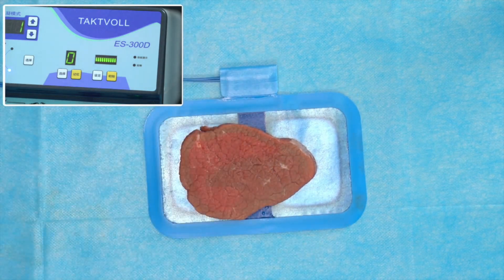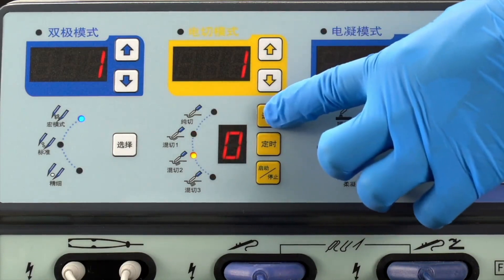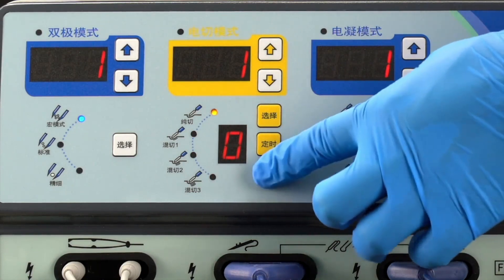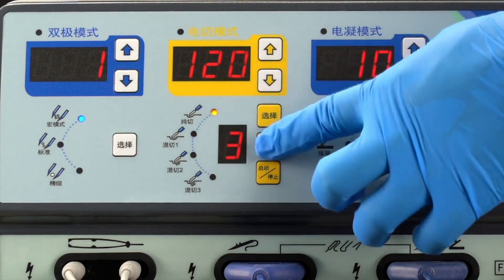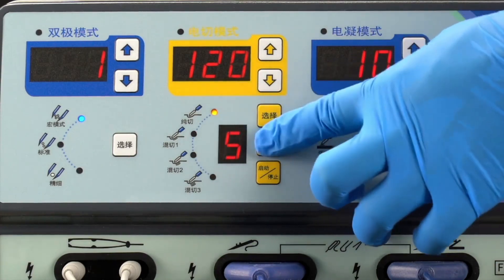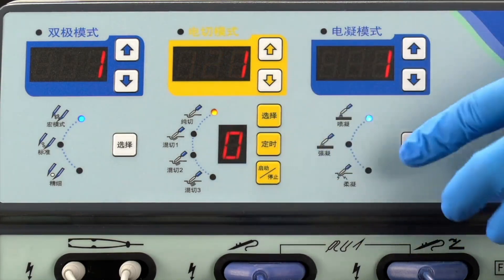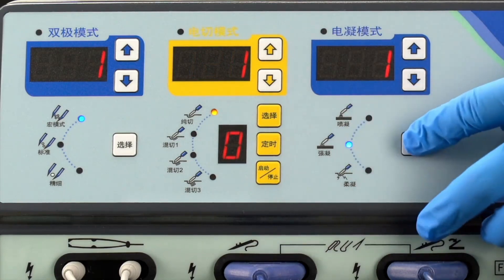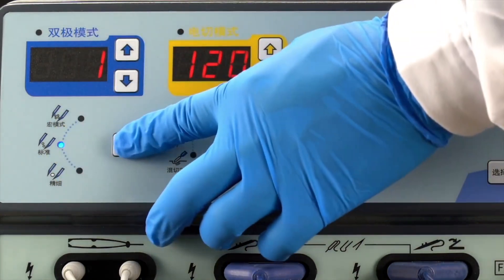The device will immediately cut off the output power to ensure patient safety. In cutting mode, the TactFall S300D can switch between one pure cutting mode and three different blend cutting modes. It can also be easily converted through device function preset to realize the EndoCut endoscopic cutting function. The device has three coagulation modes and three bipolar coagulation modes to provide abundant options for surgical operations. The maximum bipolar output power is 150 watts.